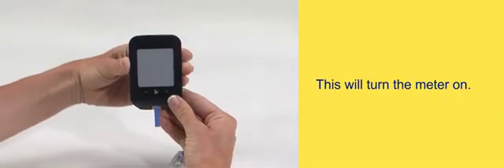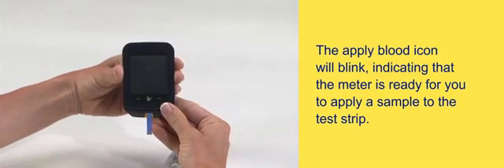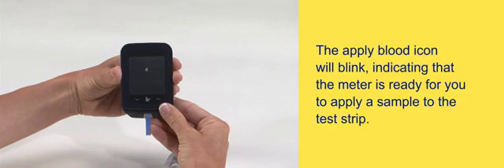Insert the test strip into the meter until it stops. This will turn the meter on. The apply blood icon will blink, indicating that the meter is ready for you to apply a sample to the test strip.